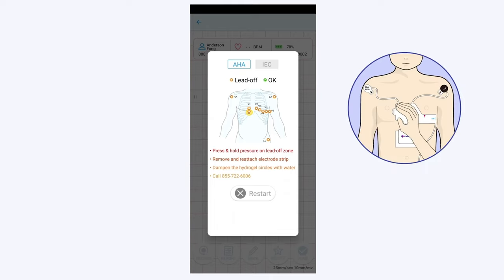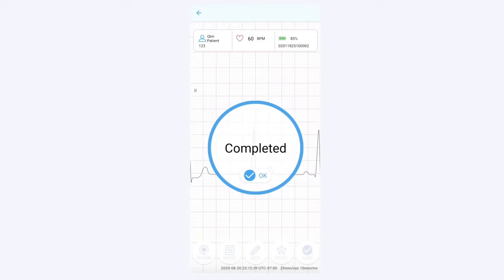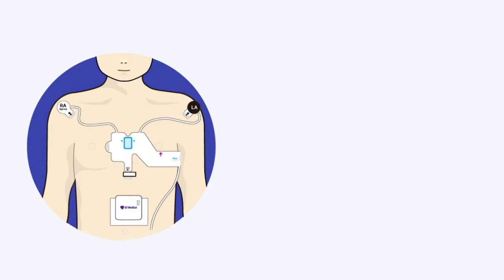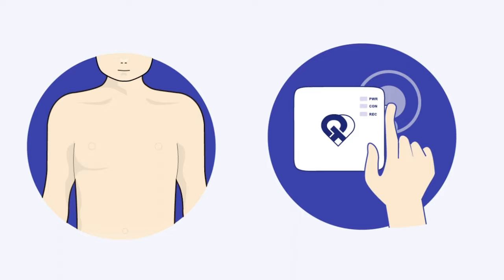If you see a troubleshooting screen, please go through the troubleshooting steps for the Q-Heart sensor in the indicated areas. Call customer support if needed. After completing the ECG recording, detach the recorder and remove the sensor. Turn off the recorder by holding down the power button until the lights are off.